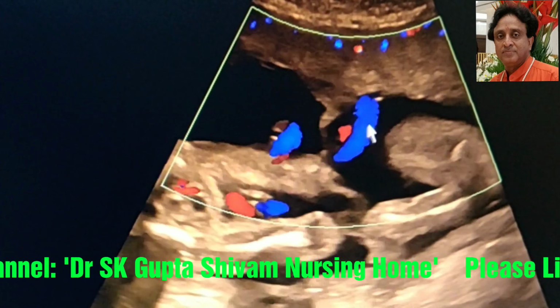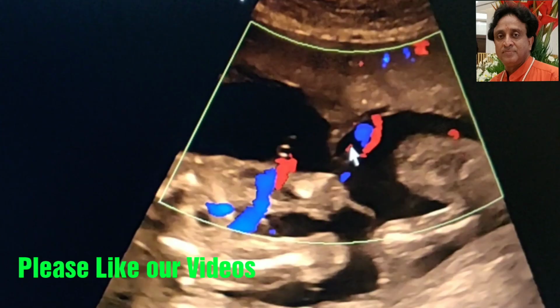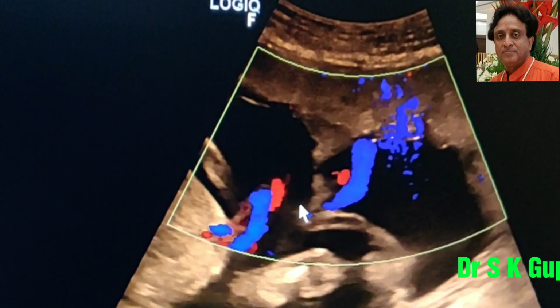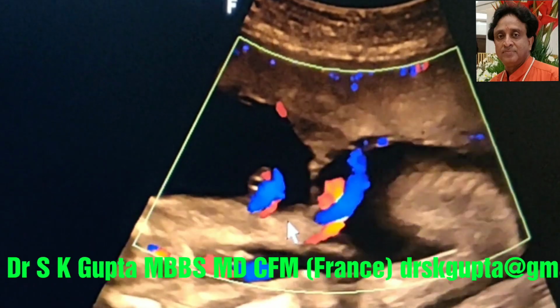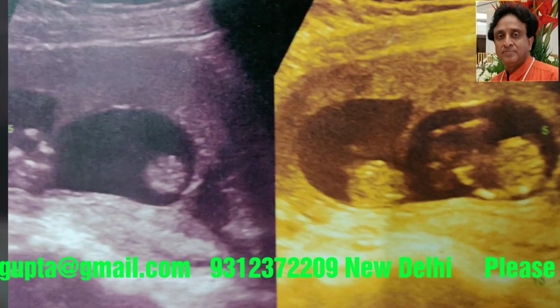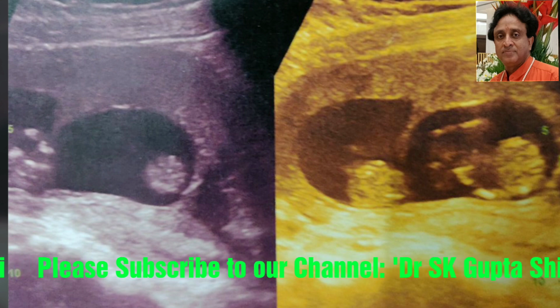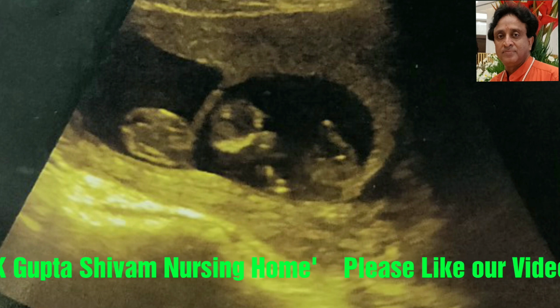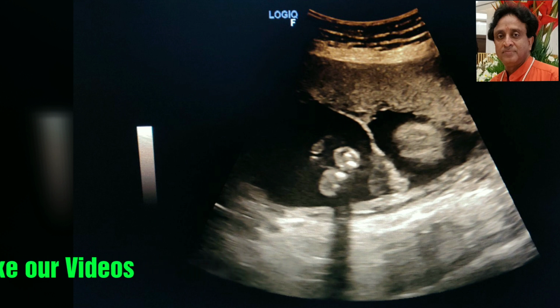Because both the placentae are not seen separately and both the umbilical cords are attached to the placenta near the center, it is likely to be a monochorionic pregnancy. But initially, while doing this ultrasound, I had the opinion that this may be a dichorionic pregnancy also. The presence of a T sign at the intertwin membrane placental junction is indicative of monochorionic twin pregnancy, while the presence of a lambda sign indicates dichorionic pregnancy.